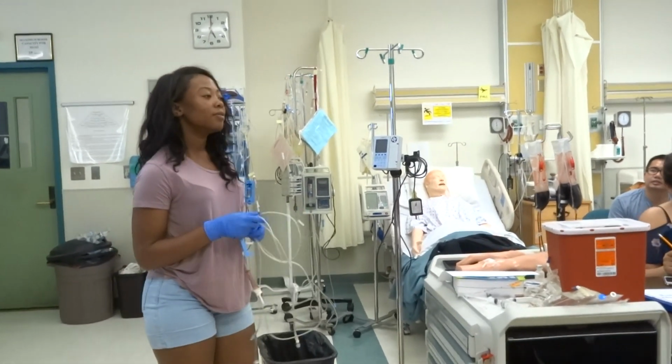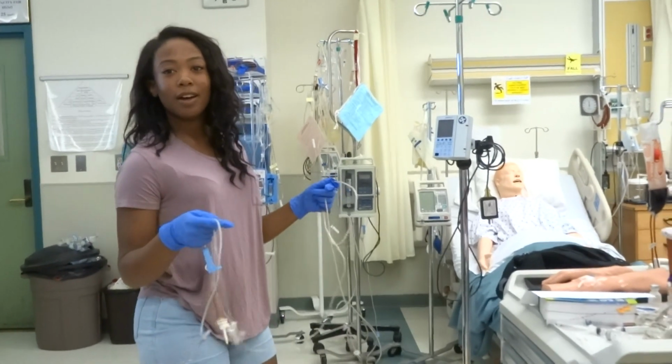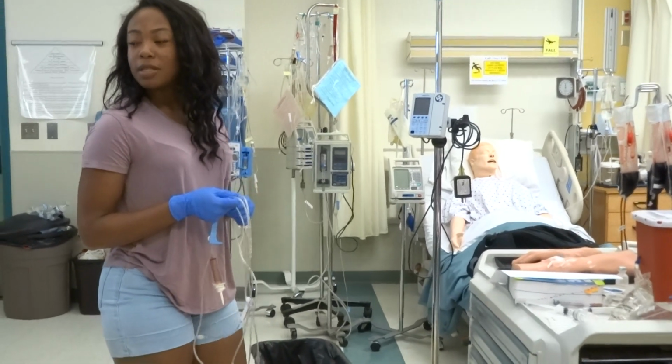And just make sure everything's prepped, basically. Yeah, that's probably where you mess up. Well, it depends if you already have a primary line running. Oh, you prime the primary, and then you don't prime the secondary. Right? You do. Secondary. Yeah.